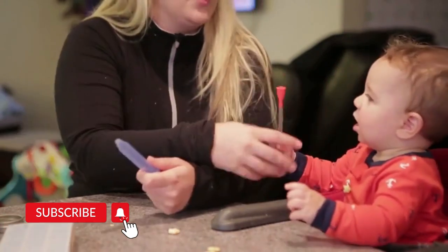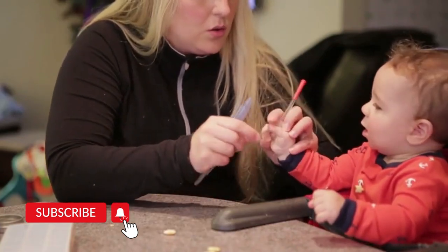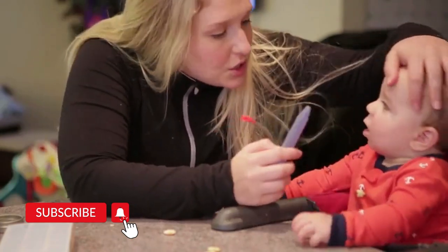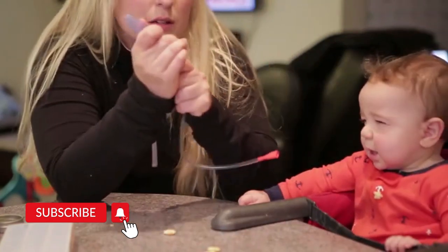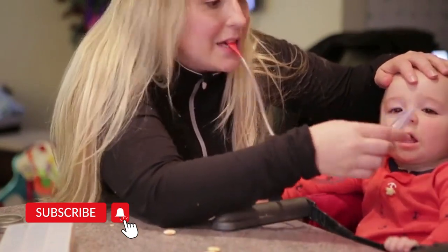I usually have my husband help — he'll hold the baby's head a little bit so I get a firm suction. You really just put it up there, make sure it clicks, and then you suck.